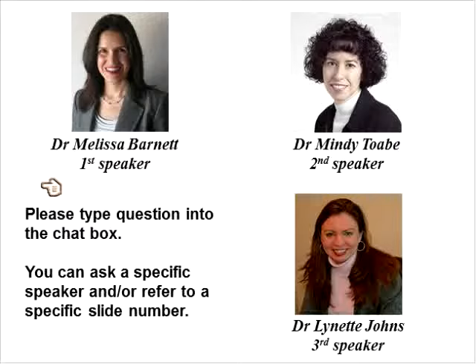That sounds good. And one thing I do is I put way too much fluorescein in the inferior cul-de-sac so that it's sometimes even dripping down the cheek. And I like to overload with fluorescein because I want to see if there's a good amount of uptake of fluorescein within the first 5 minutes or so. And if there's not, then the landing may be a little bit too tight. On the other hand, if you have huge amounts of fluorescein going immediately underneath the lens, then maybe there's a little bit of edge lift somewhere and the landing needs tightening some.